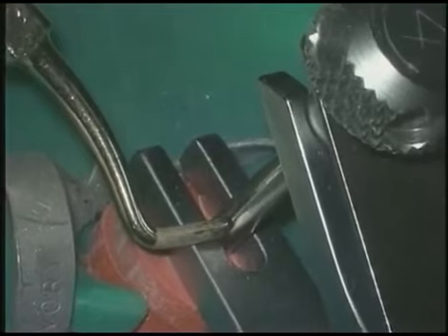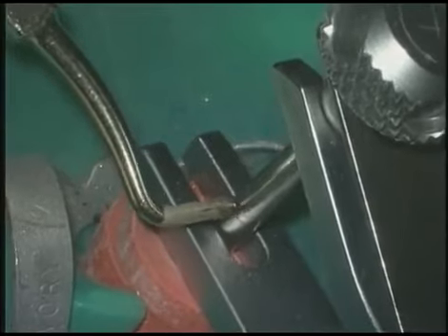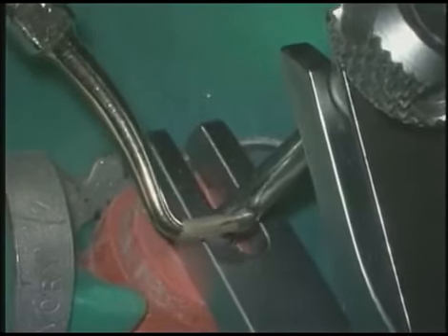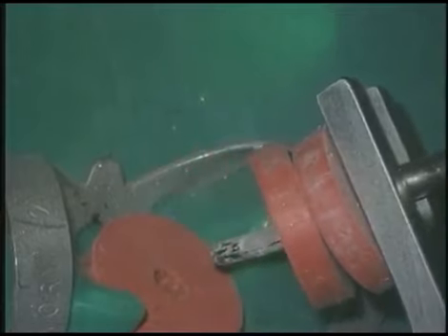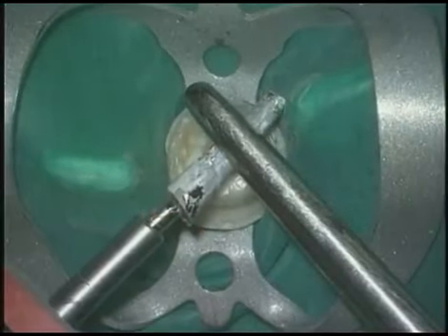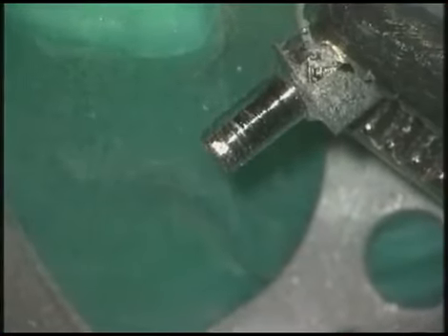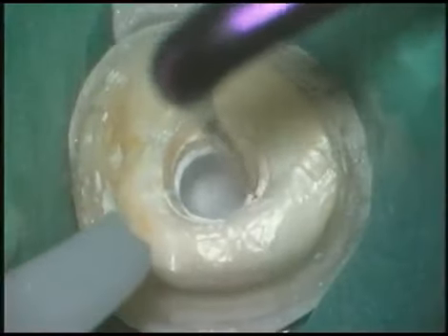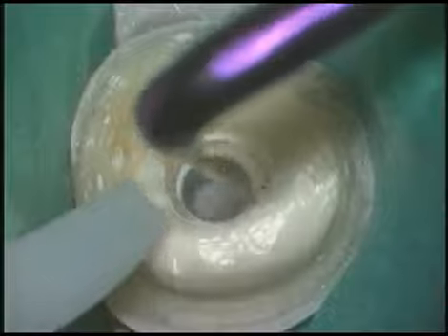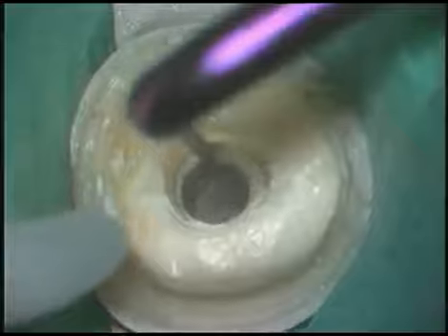And ultrasonic energy will pass through the tube, down into the post, and begin to generate cement bond failure. Progress with ultrasonics until the mandrel and apparatus frees up and elevates the post from the root canal system. It's useful sometimes to see the power of the system. With the liberated post, you can see that just 2 or 3 threads are sometimes all that stands between success and failure. I like to select an ultrasonic titanium instrument because of its smooth, efficient cutting action.